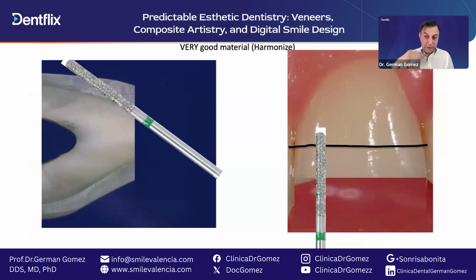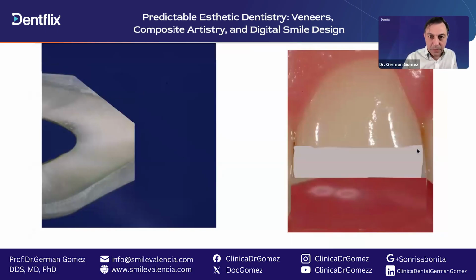Why? Because we have to layer over it. We have to make several layers so that this line cannot be seen. But now we have this line, and we need to make this line invisible too. How do we do that? With the second bevel.